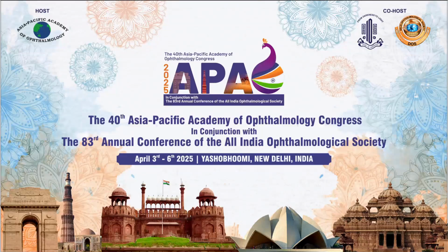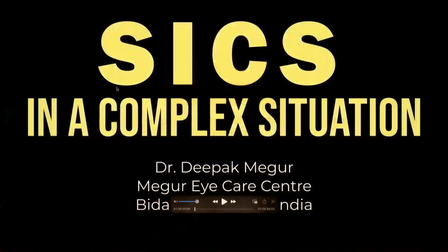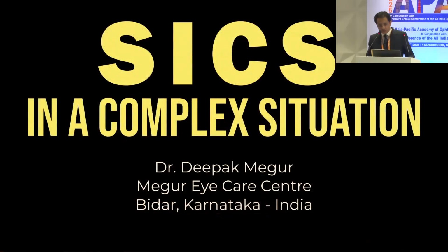I'll just take you through a couple of scenarios here, so there is no situation in which SICS is not suitable. That is the reason why Dr. Boramani always says, I learned this quote from him, that there are few situations where phaco is not advisable or cannot be performed, but there is rarely a situation where SICS has to be avoided or is contraindicated. So let us go through a few examples here.